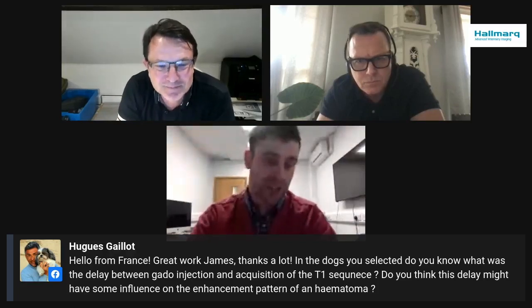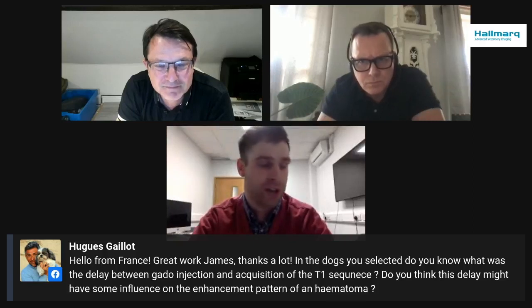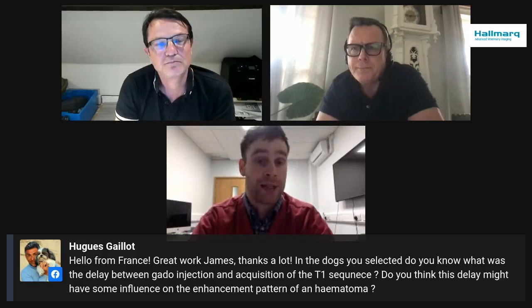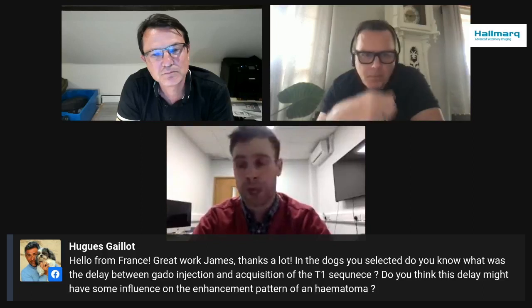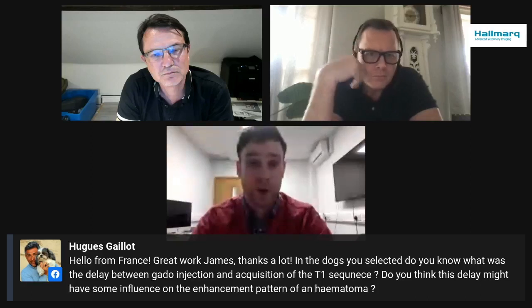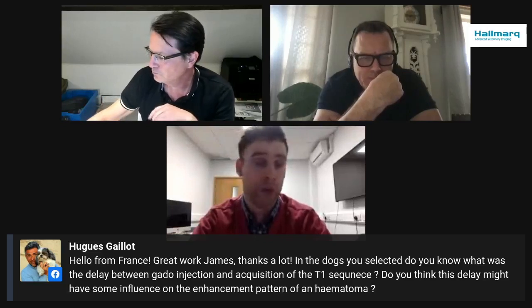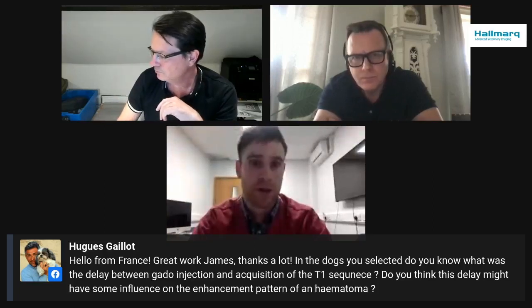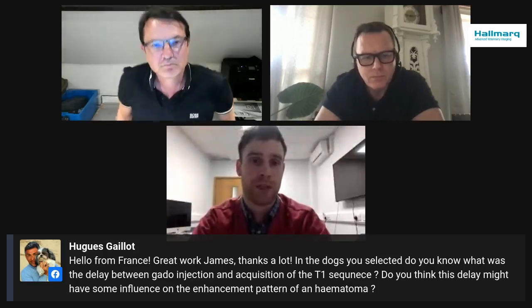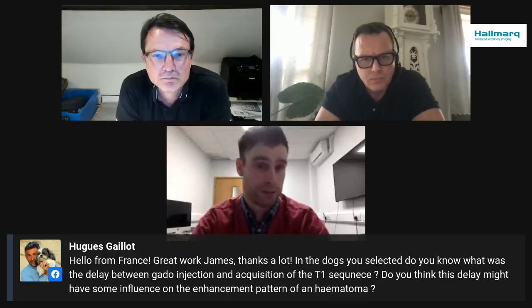Okay, yeah, that's a really good question. And in all honesty, I do not know, because this is a multicentric study, and I don't know what the timings would have been for all the studies. I can only speak for the few here at Willows which displayed peripheral enhancement, and that would have been literally a matter of a minute or so. That's typically how we run things here. But that's a good question, and I don't know.